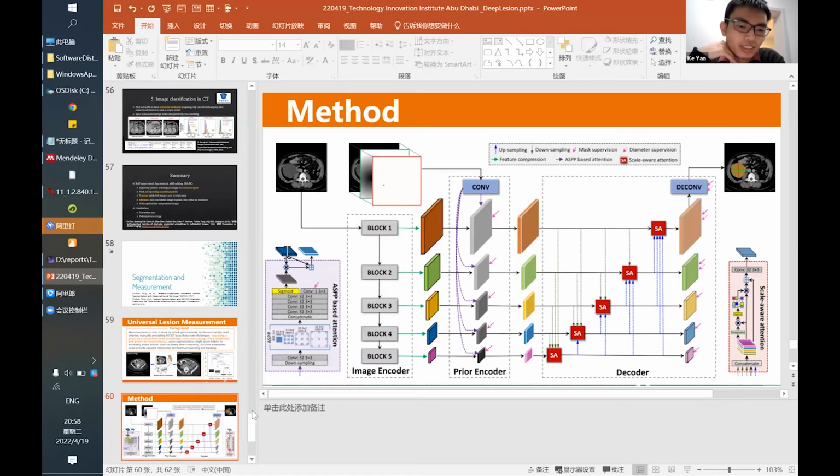One challenge is your third question, because there are different CT vendors, with different parameters and different patients, and there could be some domain gap between different images. So if you train your model on one hospital and test it on another, there may be some accuracy drop.